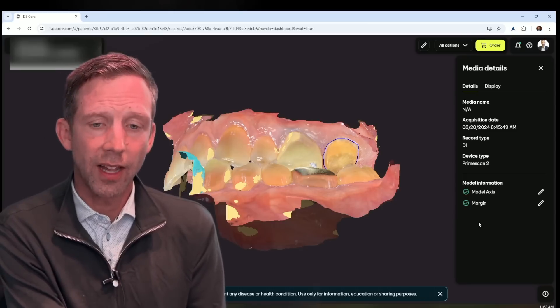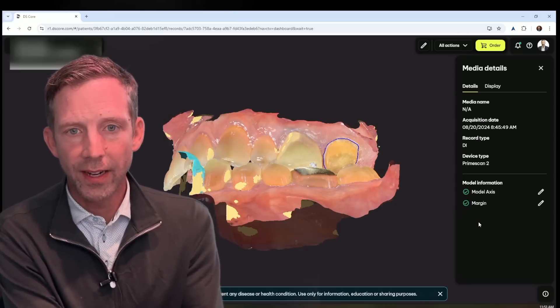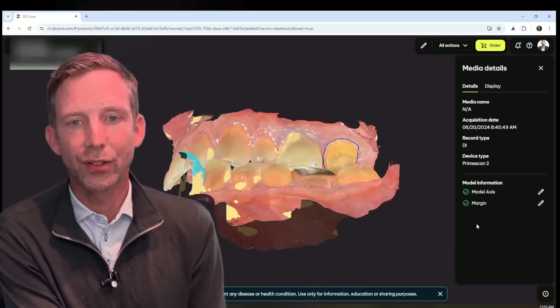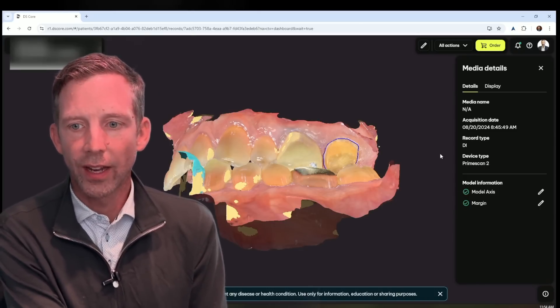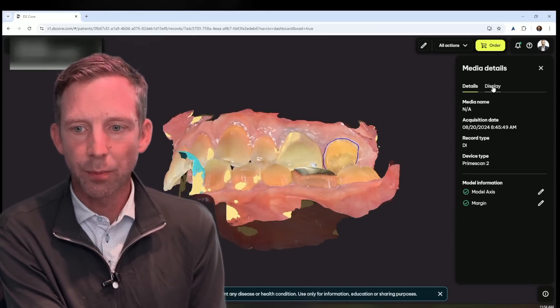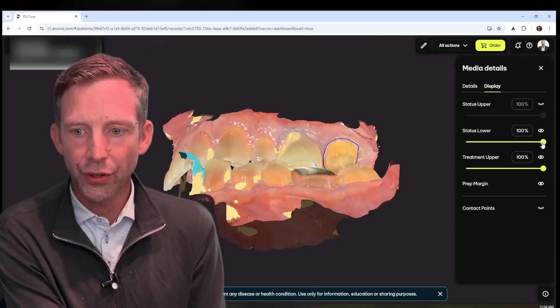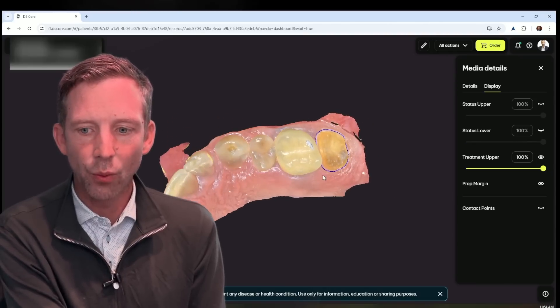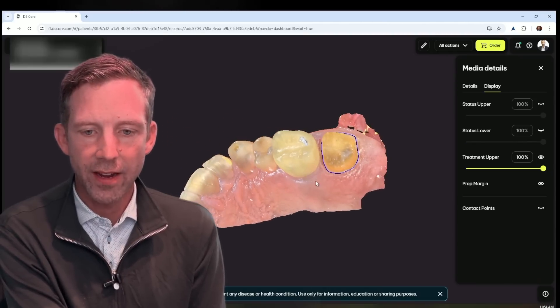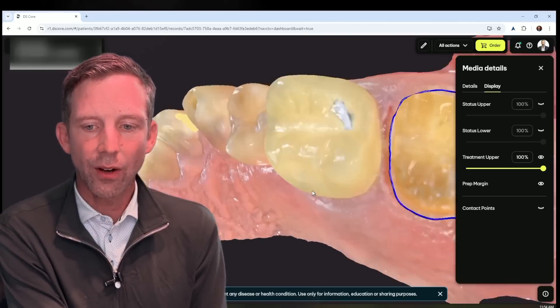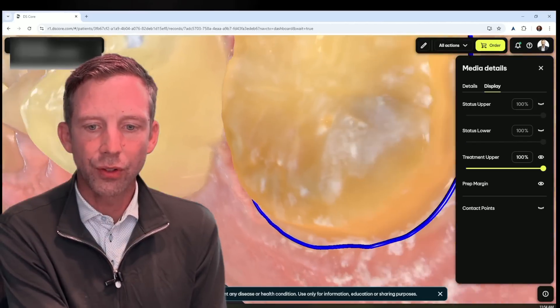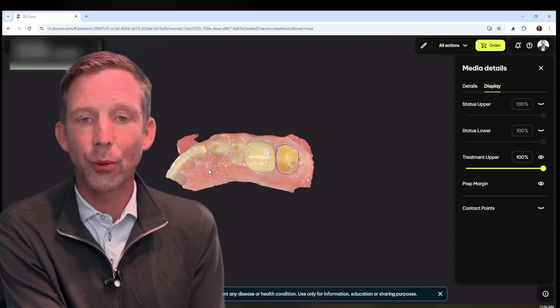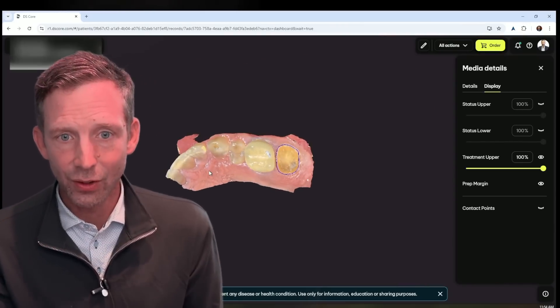So if we look at the display, we'll go ahead and turn off the lower jaw. And we can see what we have here. And not only that, you're able to alter the margin if you would like directly into DS Core.